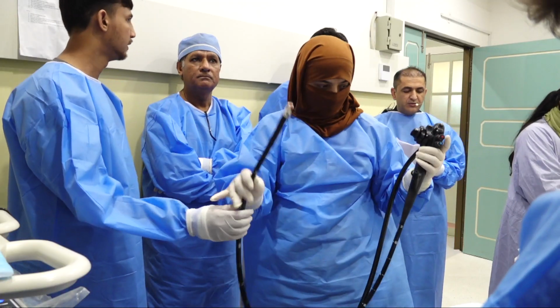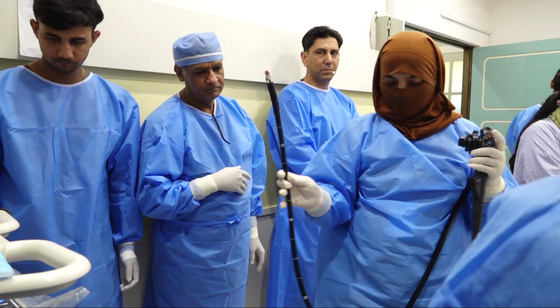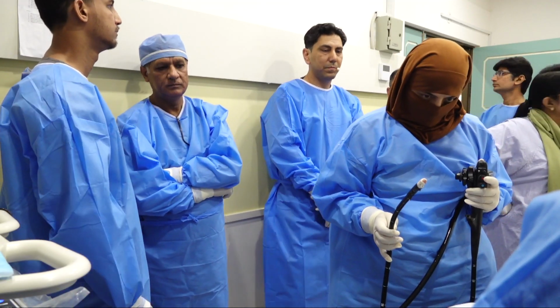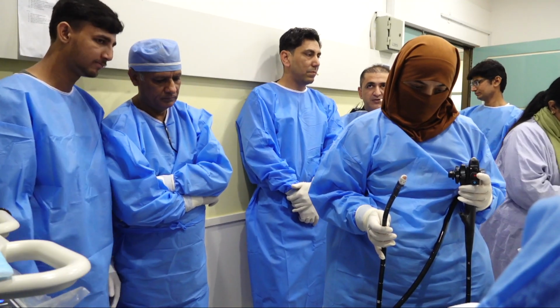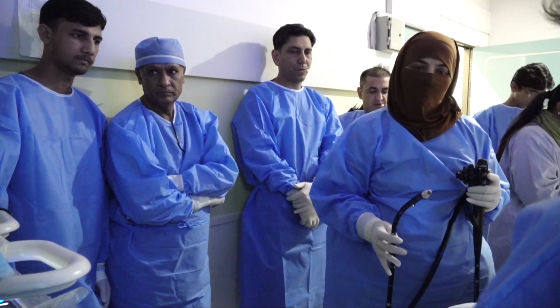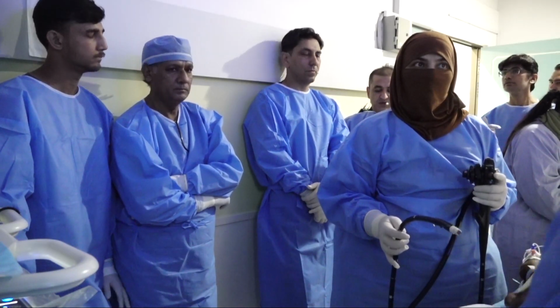Assalamu alaikum, sir. We have a patient, a 65 years old male. He's a US guided biopsy case of adenocarcinoma of pancreas. Recently we had a CT scan done that is showing mediastinal lymph nodes. So our aim is to assess the mediastinal lymph nodes, whether they are metastatic or benign. So HB is 12.2, TLC is 19, and LFTs are total bilirubin 2.8, SGPT is 98, and ALP is 150. Okay.